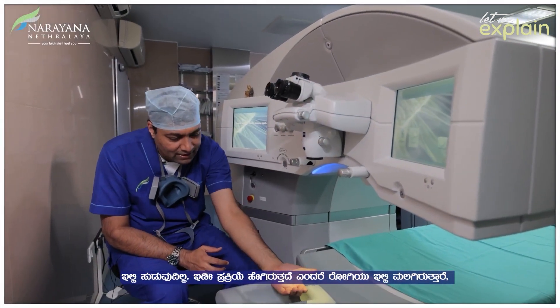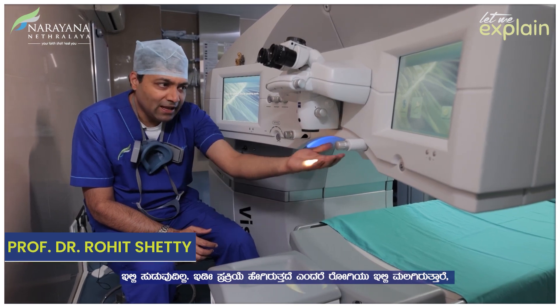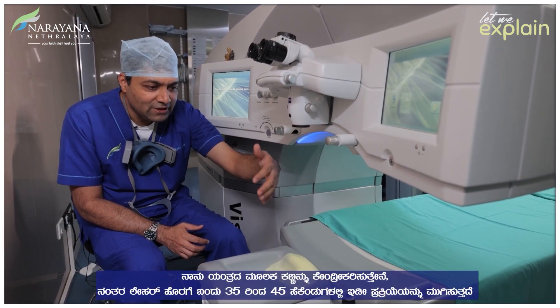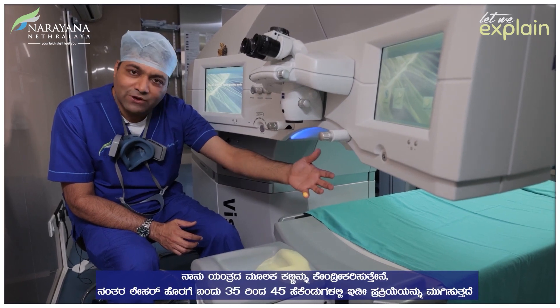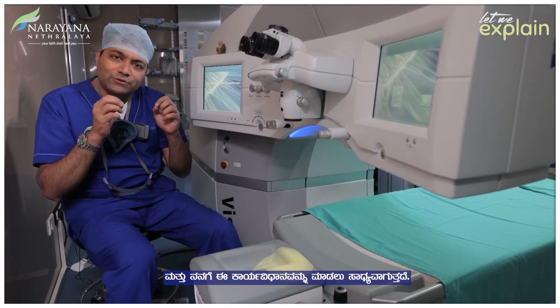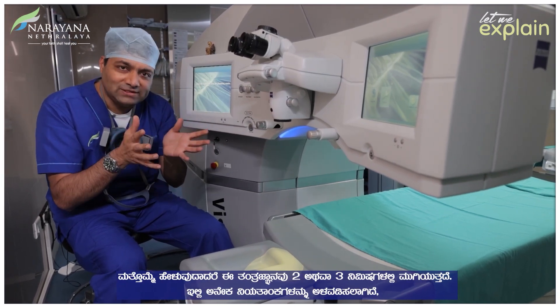The whole process involves somebody lying down here, and I focus the machine. Through this, there is a laser which comes in, and within 35 to 45 seconds the whole process is done and I am able to do the procedure. It is a technology which lasts less than 2 to 3 minutes.